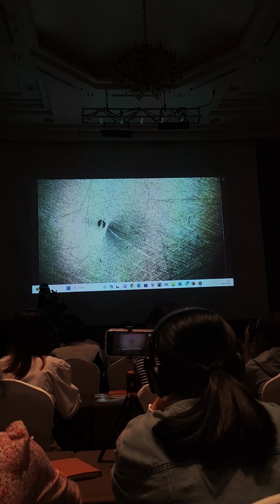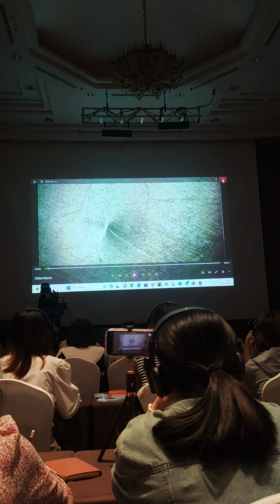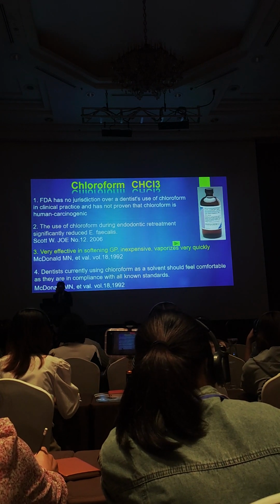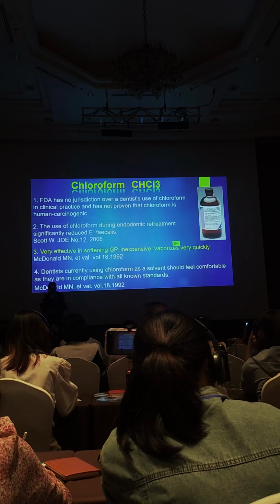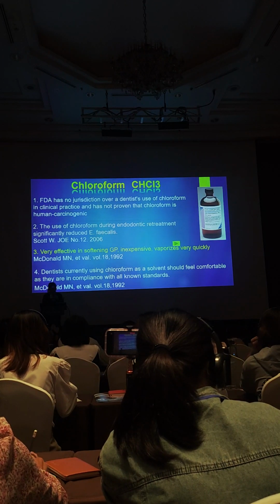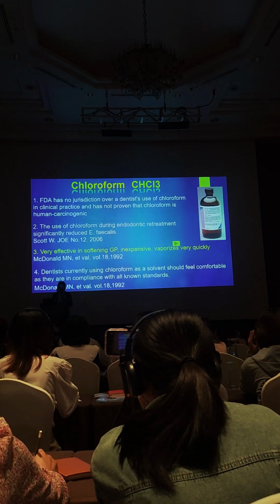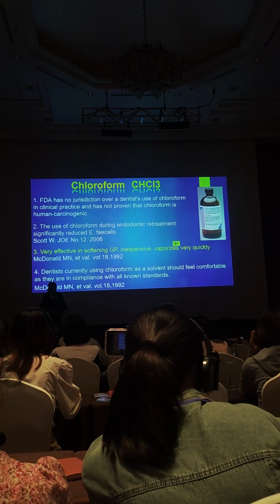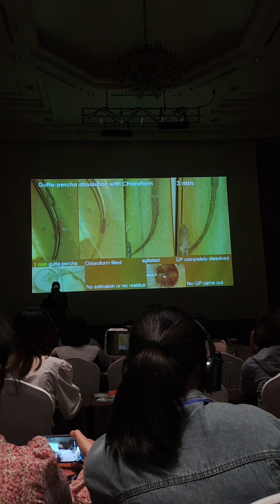And in a root canal, a drop of chloroform is enough. Dentists currently using chloroform as a solvent should feel comfortable as they are in compliance with all known standards. So it's okay. Don't worry about toxic materials. It's not toxic to humans. So this is how I use chloroform.